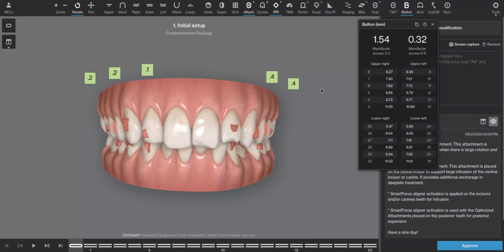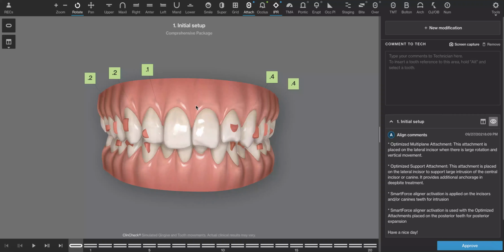That's the conventional model of Invisalign and most general dentists and orthodontists' ways of solving these kinds of problems. But like we've talked about, we don't like retraction.